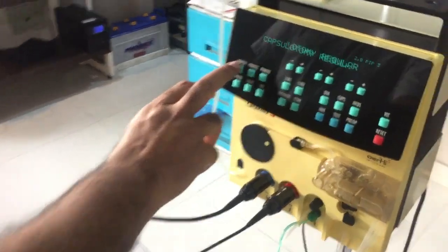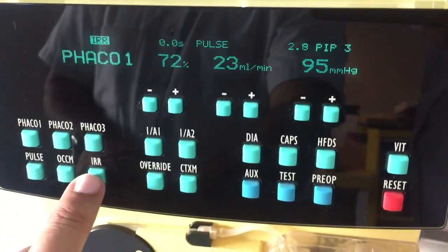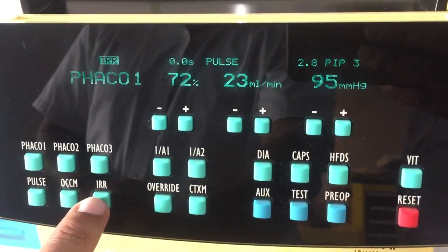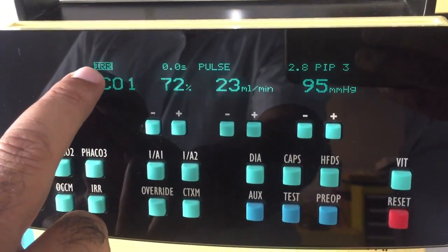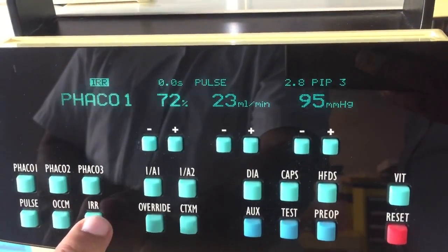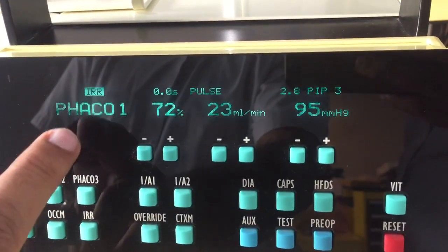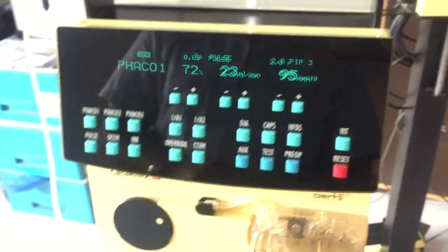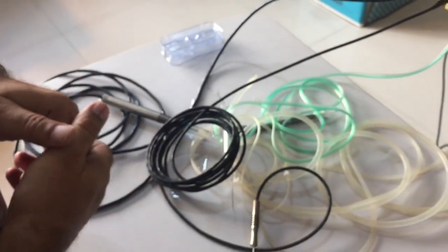In phaco mode, here is the one button. This is the IRR. This is the irrigation. This is used to activate the continuous irrigation, and here you can see the IRR on the panel. It means your continuous irrigation mode is activated. If you want to stop the continuous irrigation, you can switch it off, or you can switch it on. So this is the main function. I hope you will do it on your own in your hospital.